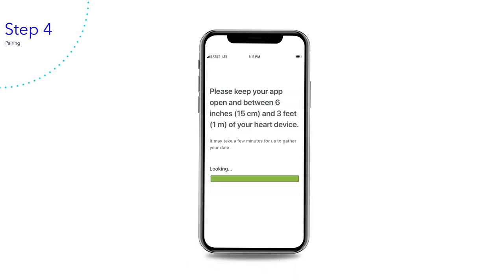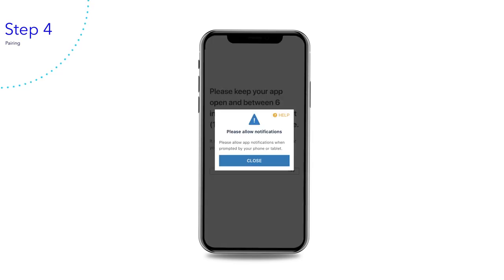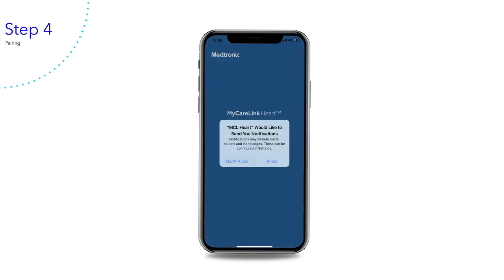Pairing may take three to six minutes. Once the green bar is full, MyCareLink heart is paired with your heart device. The MyCareLink heart mobile app uses notifications to help you stay connected to your clinic. Tap close to continue, then tap allow to enable push notifications on your smartphone or tablet.